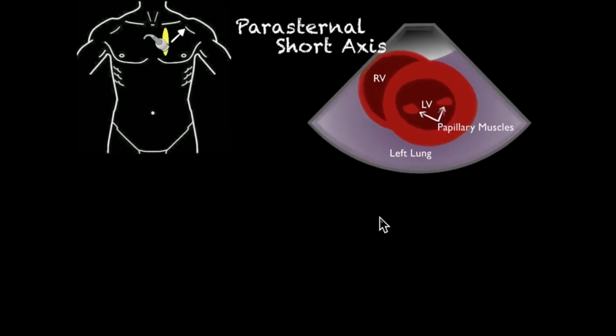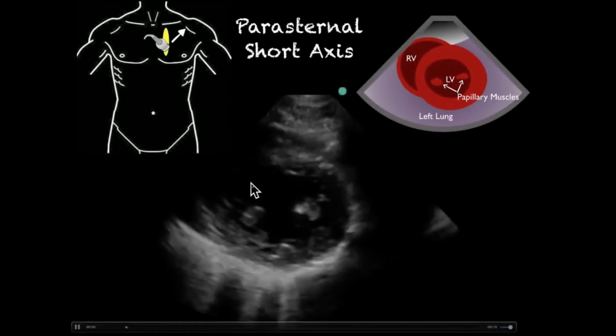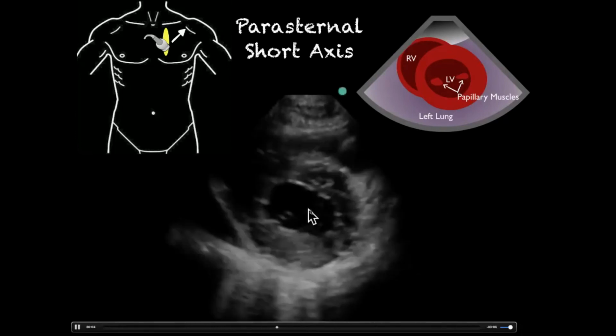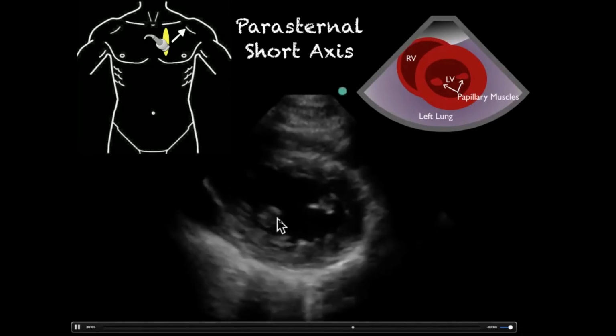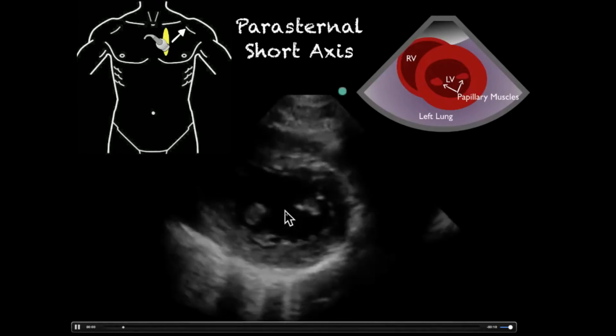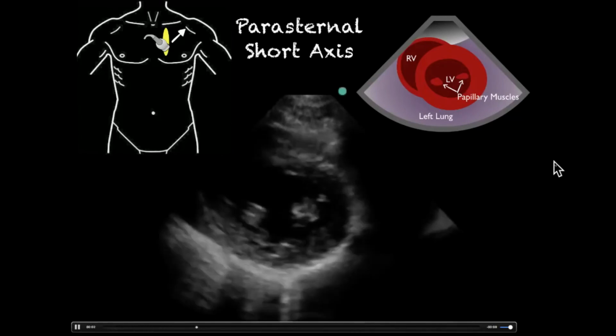So let's take a look at that here. So we see that nice thick ventricle. Looks like a donut almost, with these 2 little eyes in it, or hyperechoic structures. And I just like to imagine a little dot sitting right here in the middle of that structure.